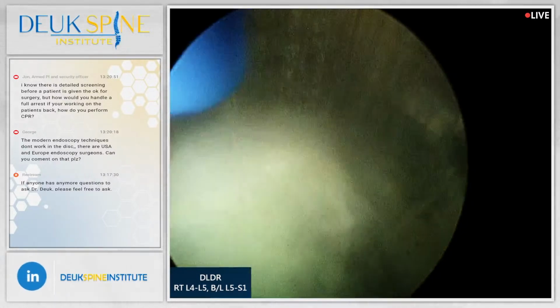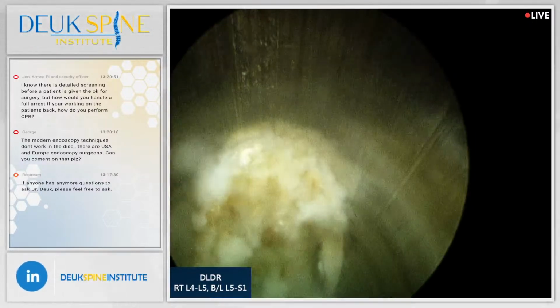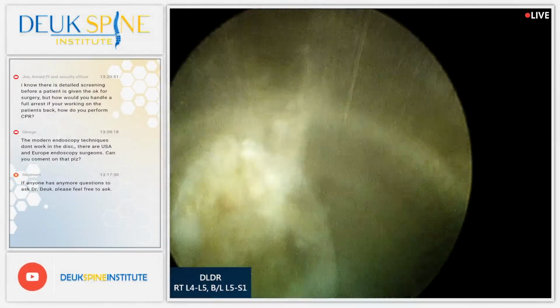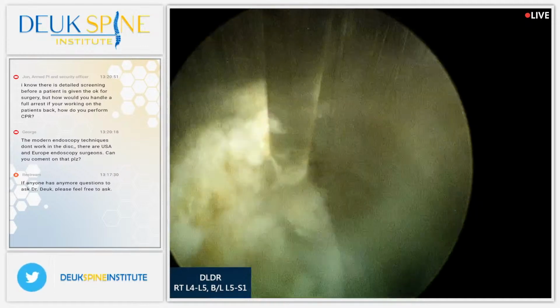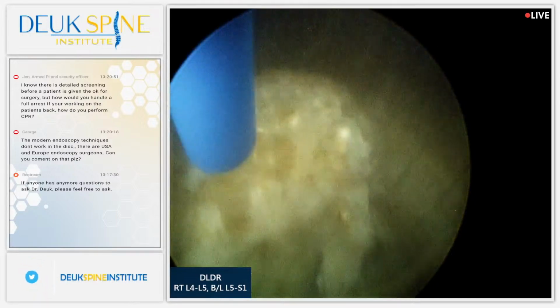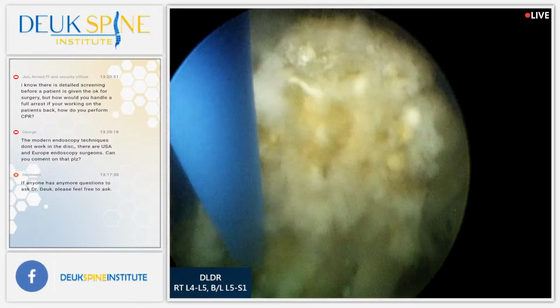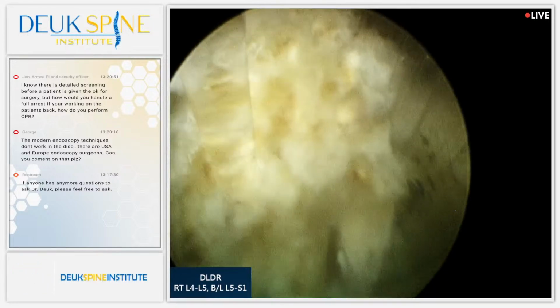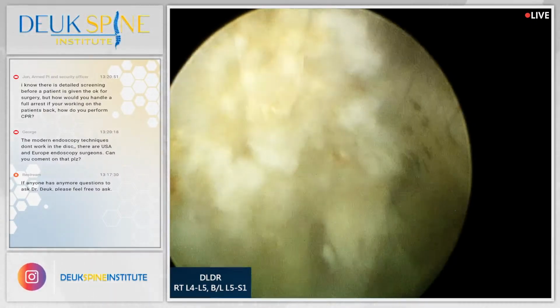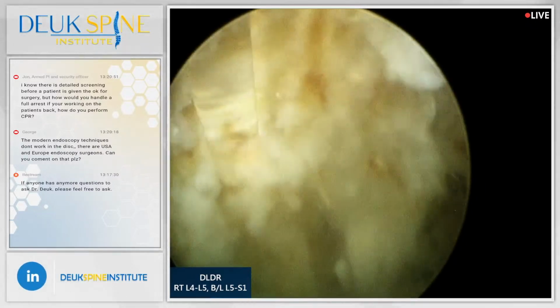This is so hard right here. This is the part that's out by the nerve too. The nerve is just outside that tube right there, to the right, right where that piece of herniation just came out of. So this stuff is all pinching the nerve root, we call it. It's very hard stuff. It's like candle wax. It's probably the best way to think about it. Hard like candle wax, cold candle wax, not hot candle wax.